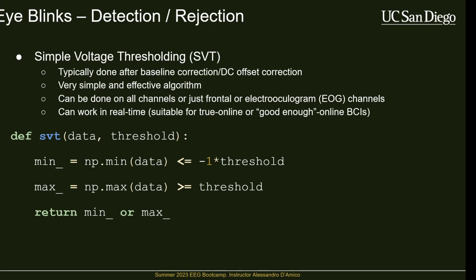You have to find some way to correct for that artifact, or risk losing that subject or that subset of the data. So there are edge cases where you just cannot throw away the trial. You need to do something about it. And that's when more complicated techniques like ICA or Gratton start to shine. Yeah, great question though. But in a lot of cases, you can just reject it and just collect more data. But again, not always possible.